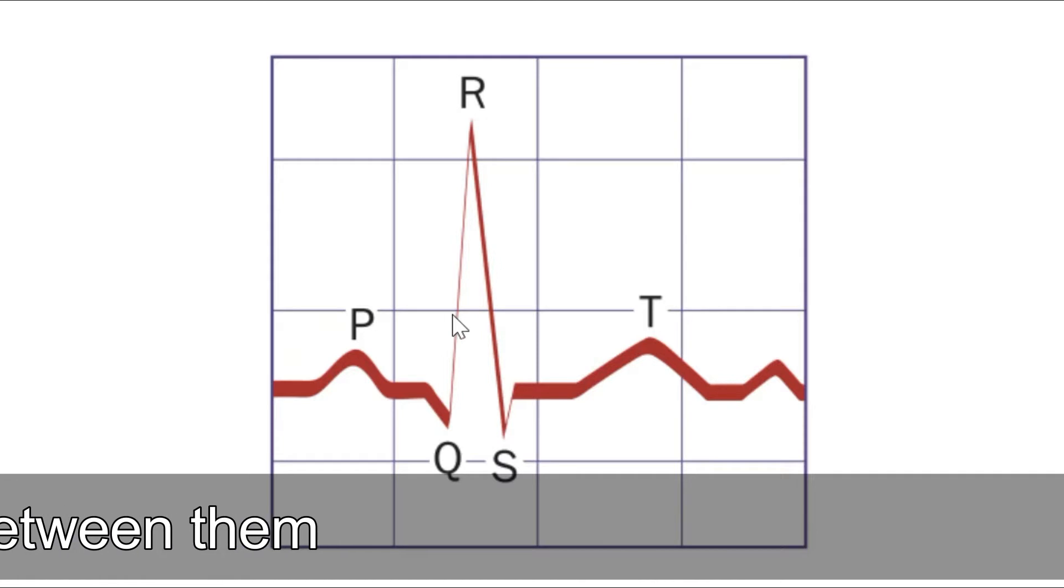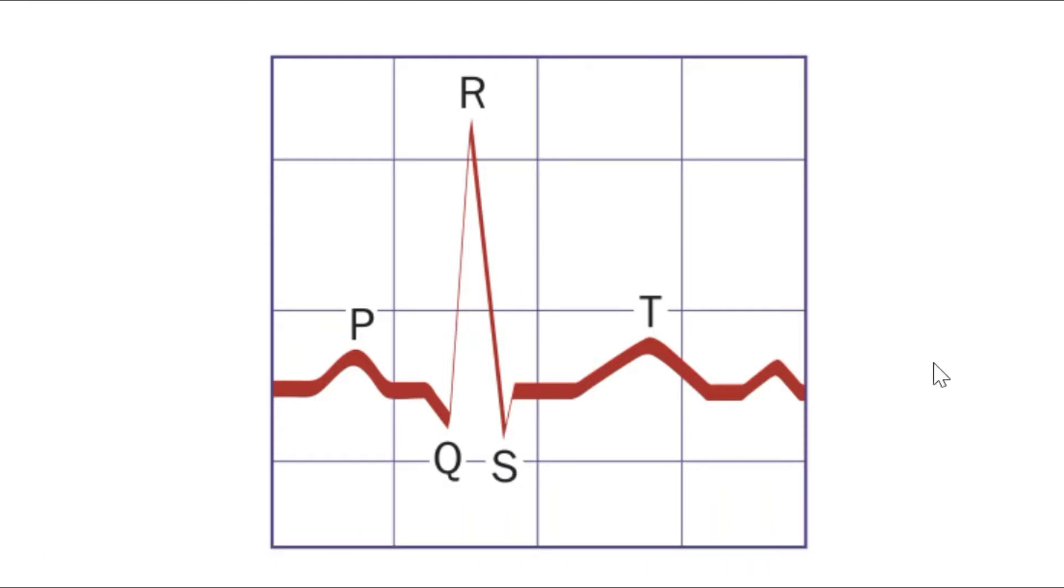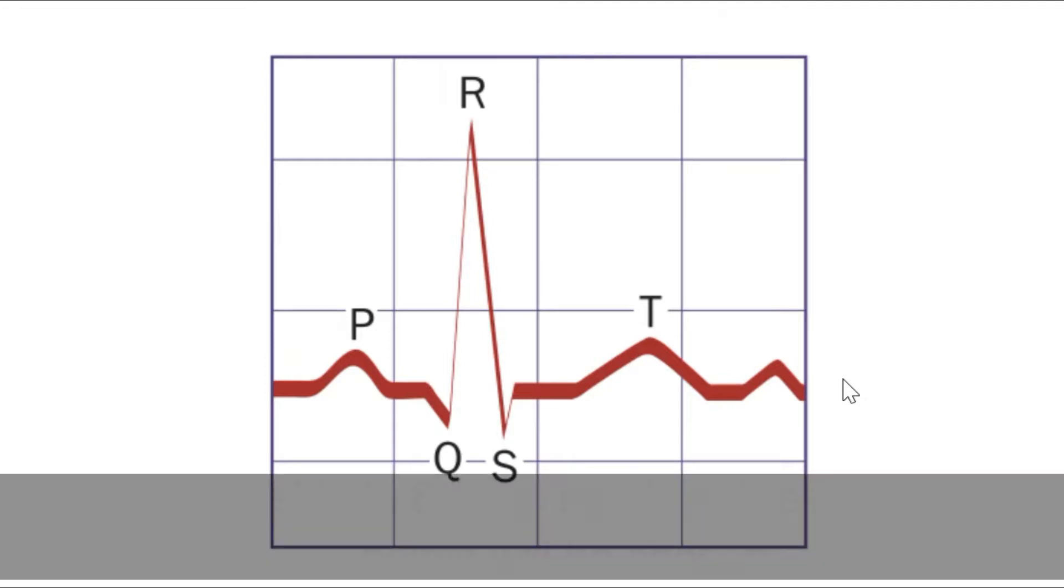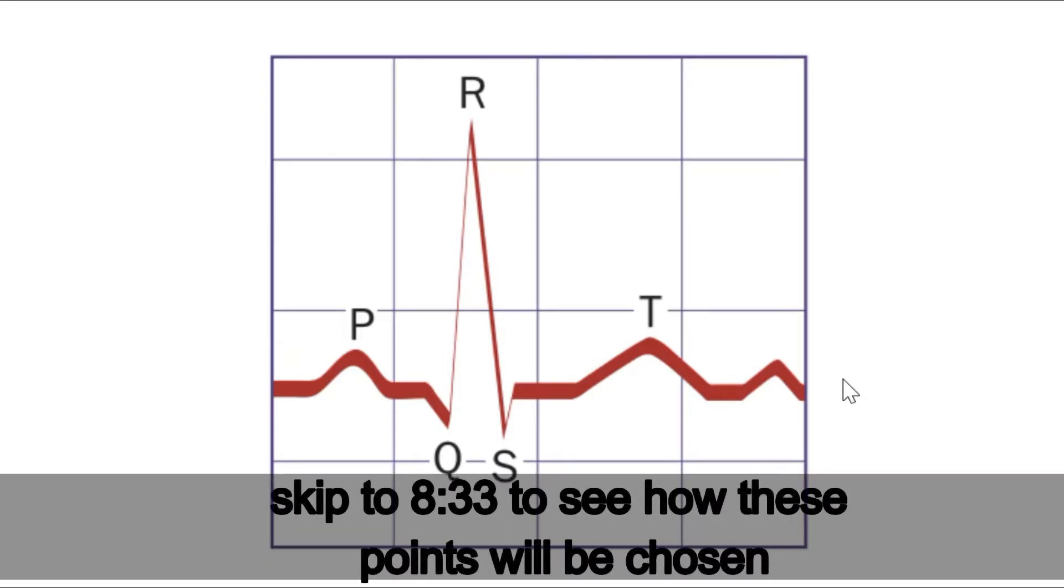Let's begin this video by focusing on this curve over here. As you can see, the P curve and the T curve look very similar. In MATLAB we can interpolate these points using something called the spline function.